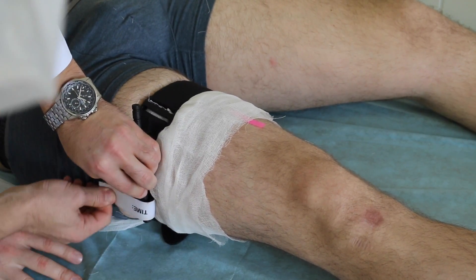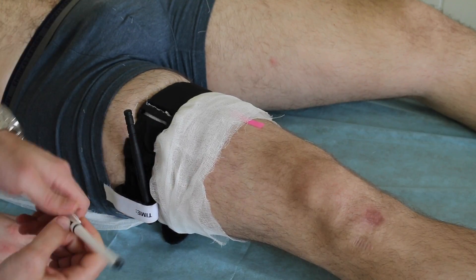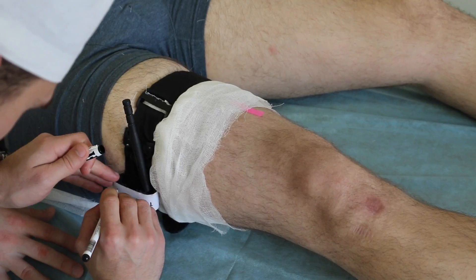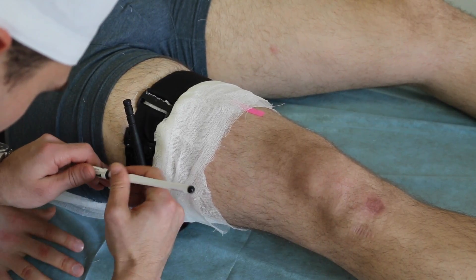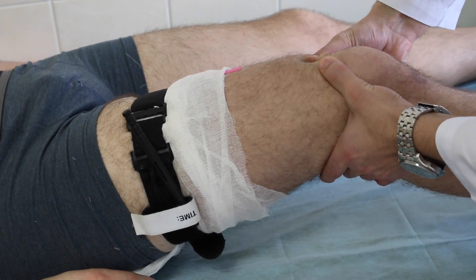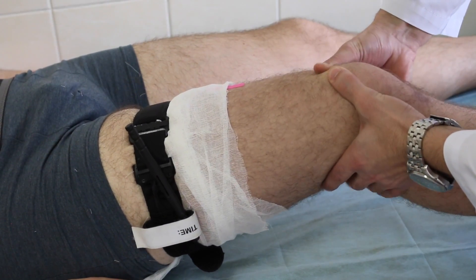Mark the victim's forehead with a T to indicate a tourniquet has been applied, and also note the time when it was applied so medical personnel will know. Criteria of tourniquet efficiency are stop of the bleeding in the wound and absent pulsation on distal arteries.